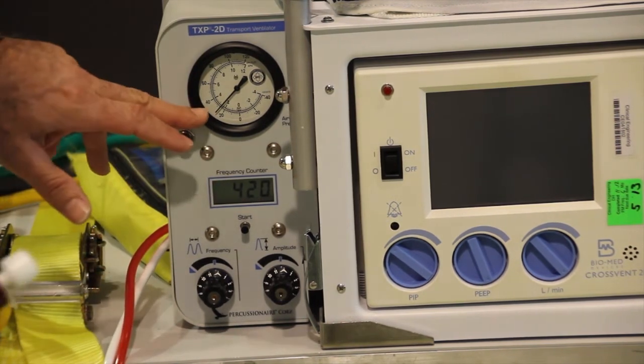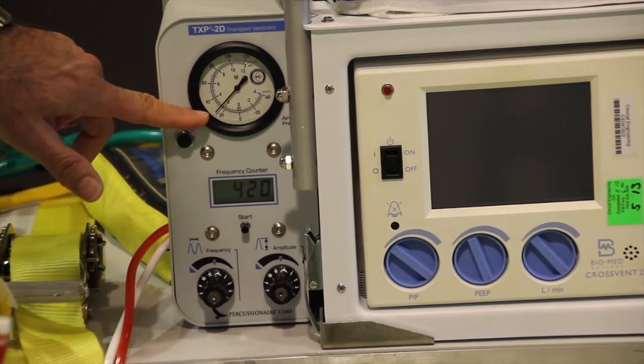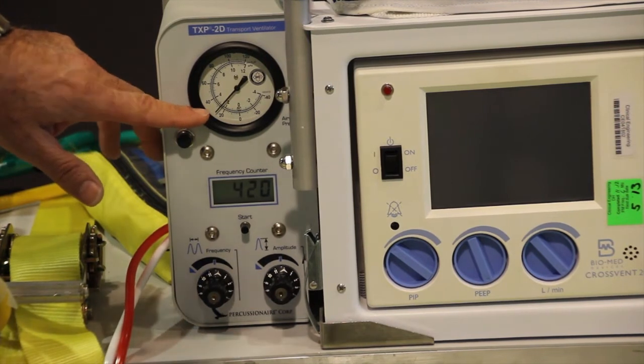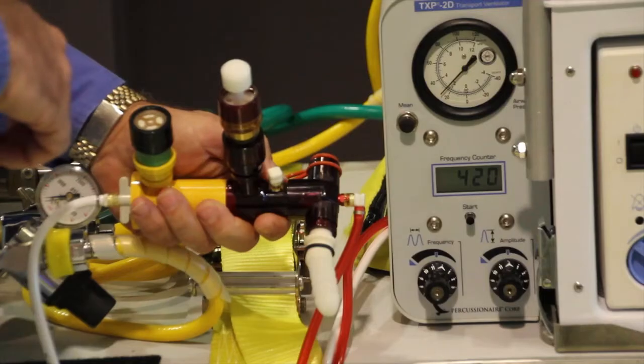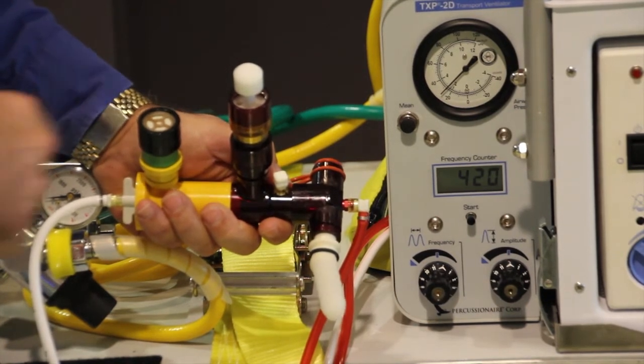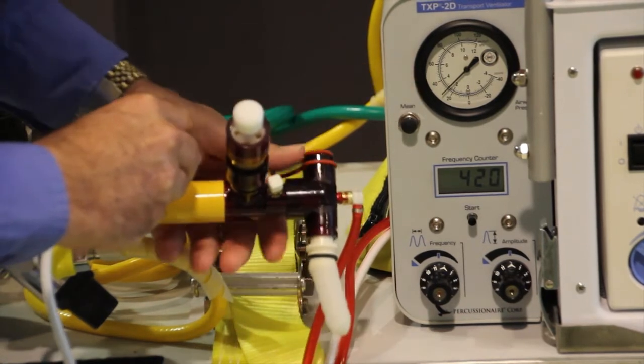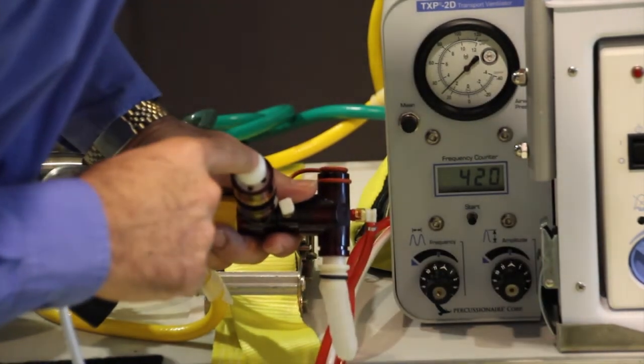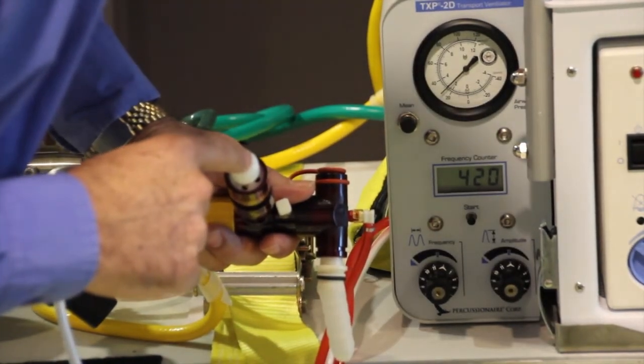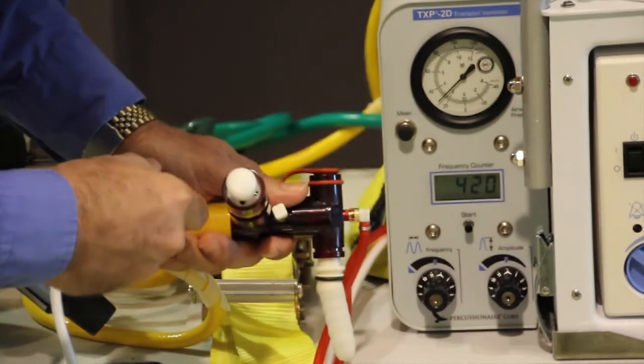Then we're going to match the mean airway pressure. To keep it simple, I don't know if you can see on the manometer right here, but we're probably around 26 to 28, something like that. I'm going to adjust my manometer down to about 20. To adjust the mean airway pressure on the manometer here, I'm going to dial my peep knob counterclockwise.